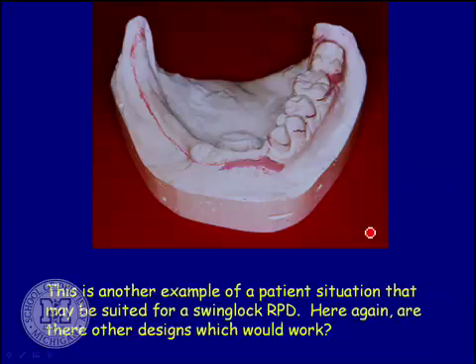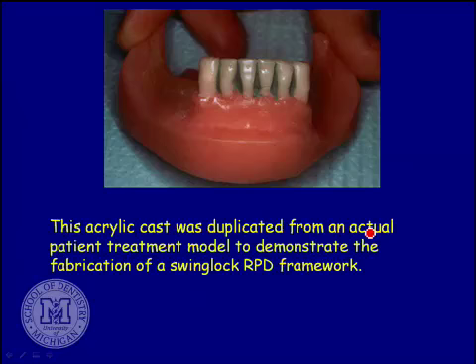So here's a situation also where some of these, as I say, if you've got a situation that's more like a maxillofacial case that you do with Dr. Z, where the number of teeth missing or the amount of defect you're trying to fill up is very extensive, it may be that the extra grip with the Swinglock may be worthwhile.